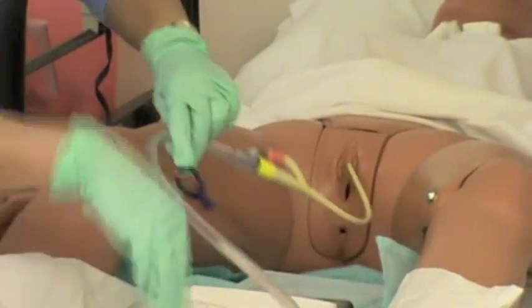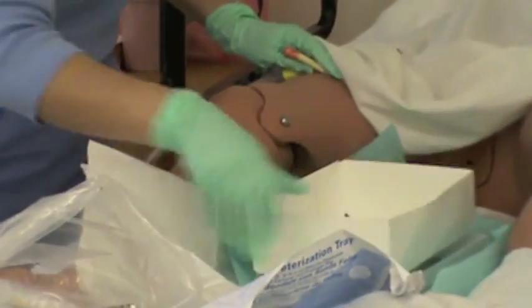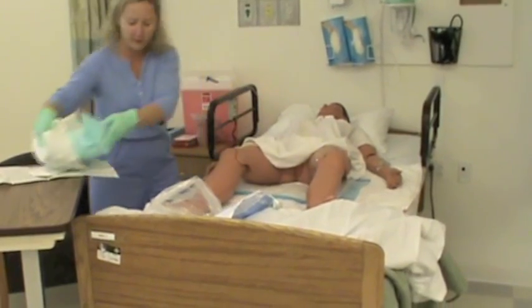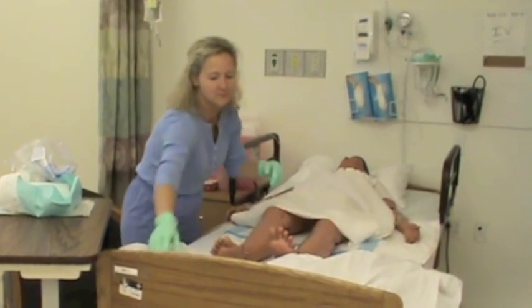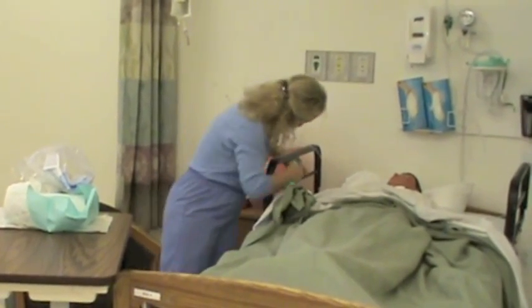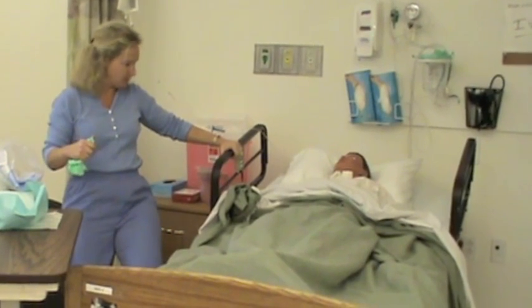I'm not sterile anymore. You did great. I'm going to gently tug that. I'm going to use a tube attachment device and attach it to the leg. I'm going to lower the bag below the bladder and attach it to a non-movable part of the bed frame, then clean my patient up. You did great, Ms. Brown. I can already see that you have 400 milliliters of pale yellow urine — you have some bladder distension. I'm going to get you comfortable, take off these gloves, put your head back up, and get the bed down to its lowest position and make sure you have your call light.